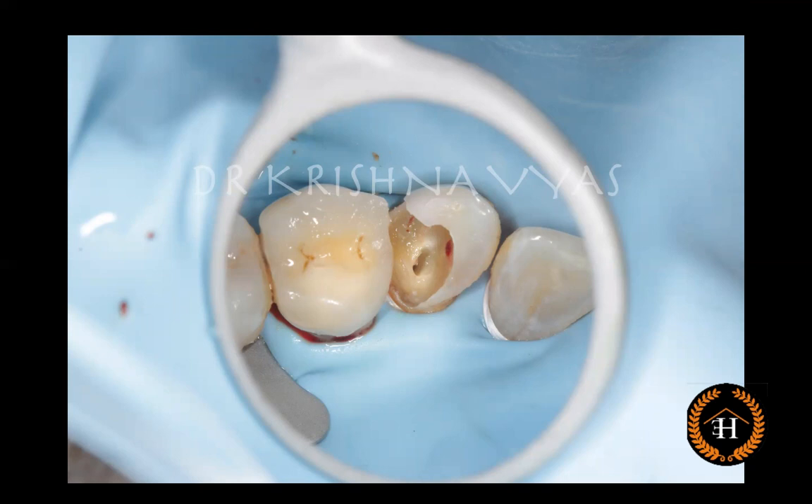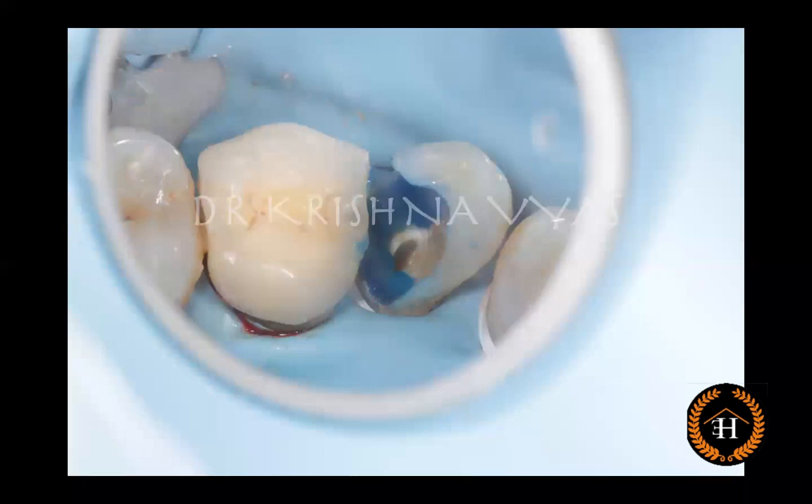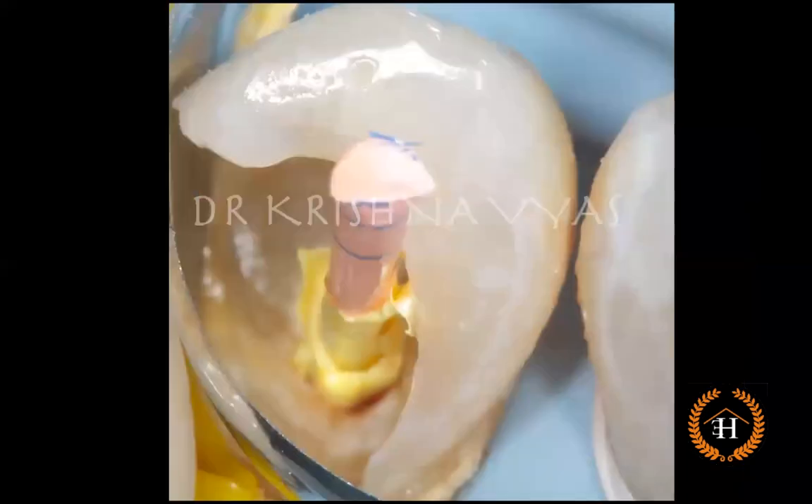Here is a canine tooth that is grossly mutilated. All caries excavation was done, and when we do caries excavation on these teeth, the orifices automatically get opened. The etching and bonding protocols were done, followed by matrix adaptation. Once the orifice was felt, only orifice enlargement was done up to three to four millimeters without complete canal shaping. In this enlarged orifice, a gutta-percha point is placed. Since canals are not always round, the gutta-percha is wrapped with Teflon tape and packed inside the orifice to achieve a completely sealed orifice.